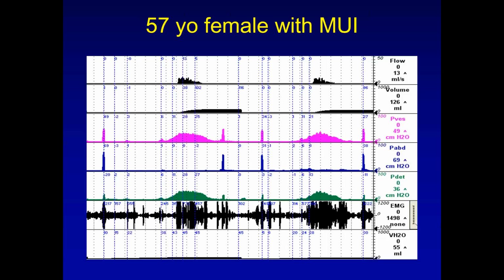I got to go. I can hold it a little bit longer, so she holds it longer. She says that she's got to go more at 38, and you can see at 38 she's got a little rise in pressure here. That is an initial unstable contraction. And then at 43, she says, I can't hold it anymore. I got to go. And boom. She has this unstable contraction.